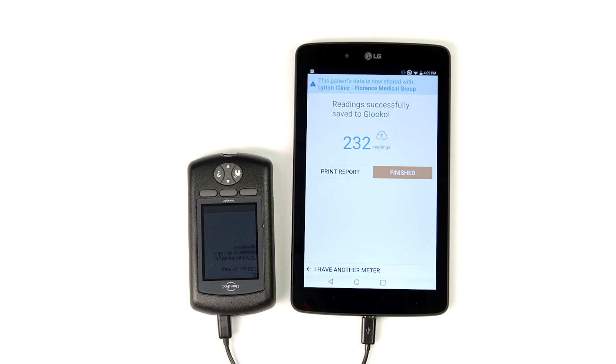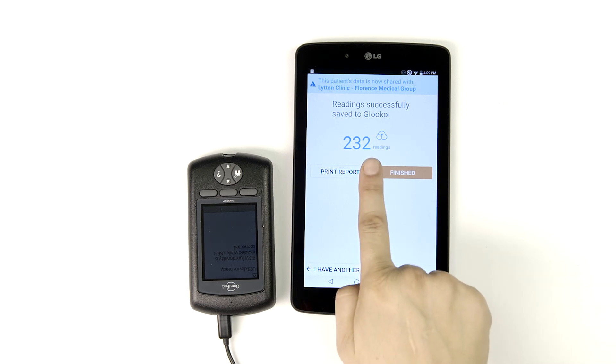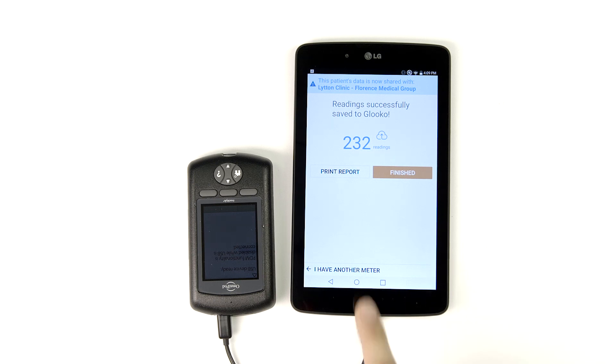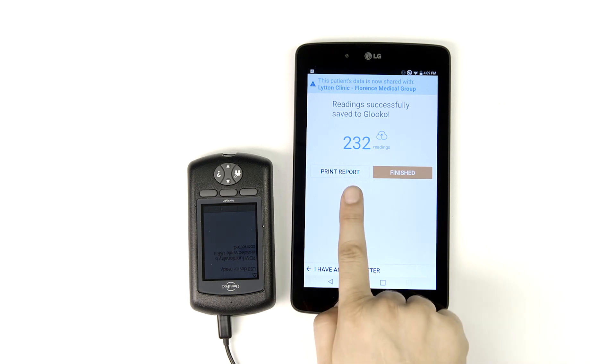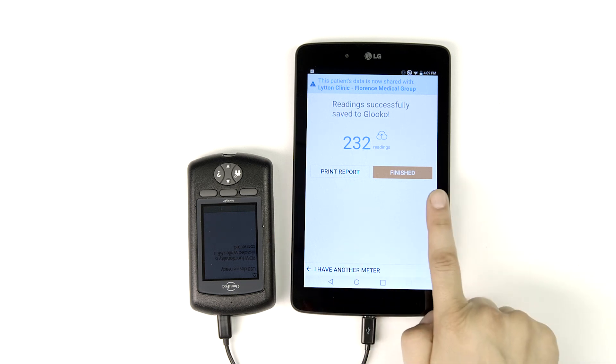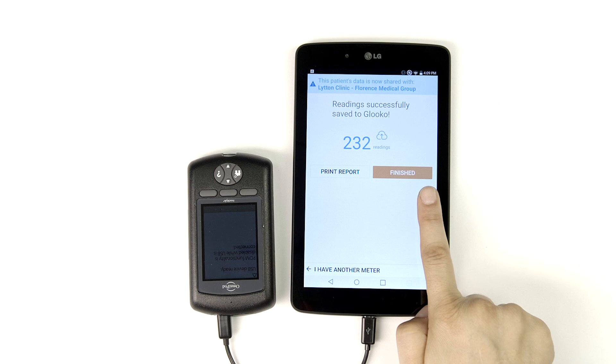The final screen of Glooko Kiosk provides the total number of data points downloaded during today's sync. From here you have several options. You may choose to print a report of this patient's data from your wireless printer, sync another device for this patient, or tap finish to move on to the next patient on your schedule.